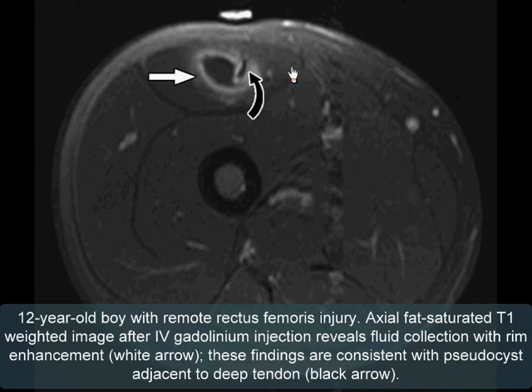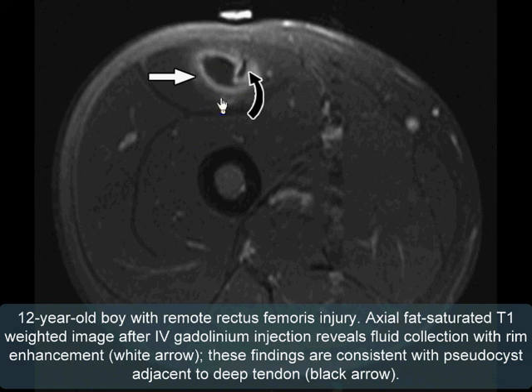This is a 12 year old boy with remote injury. Axial fat-saturated T1 weighted image after IV gadolinium reveals a fluid collection with rim enhancement. These findings are consistent with pseudocyst formation adjacent to the deep tendon of rectus femoris after remote rectus femoris injury.